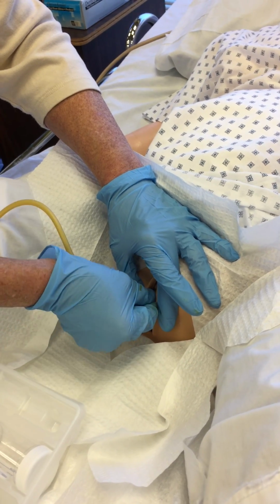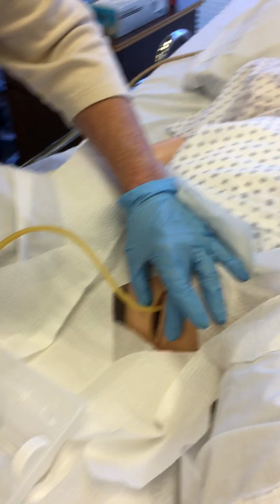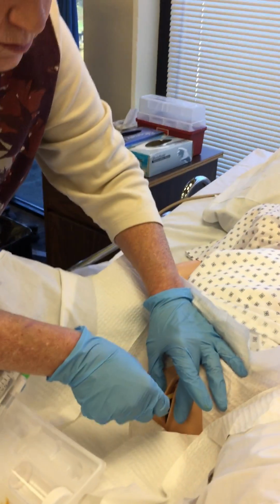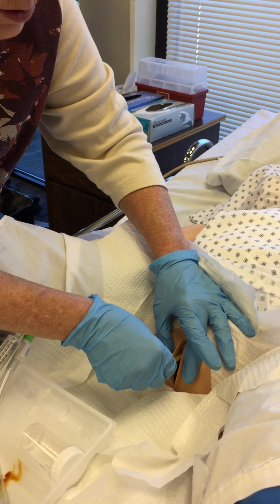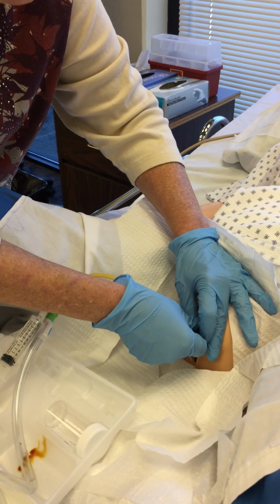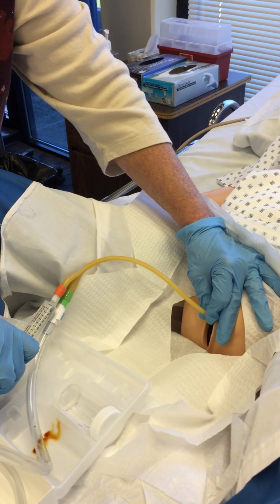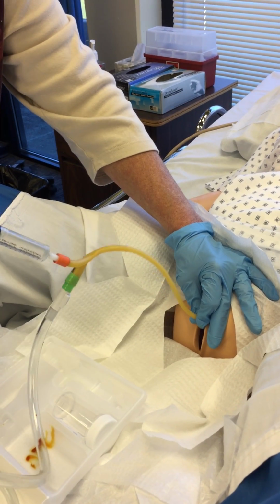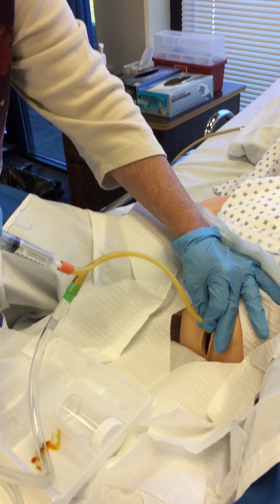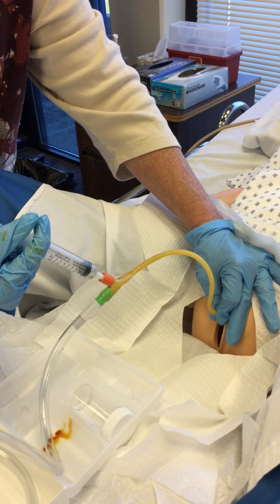You're going to go in a female until you see urine. You'll see urine start right here in your tubing, which is great. Once the urine starts, you go on another couple inches. Then you can hold this with your dirty hand. Blow up your balloon. Your balloon should blow up easily.